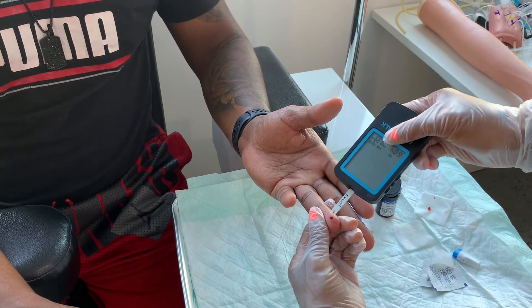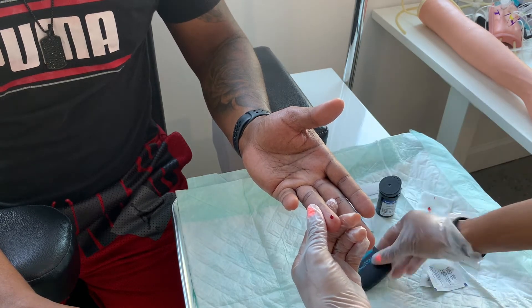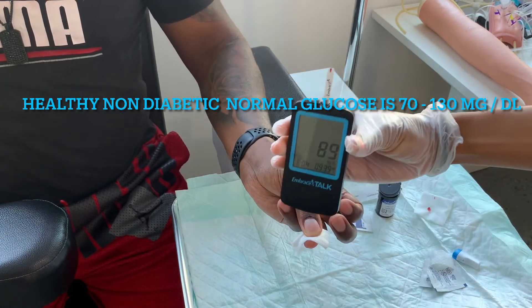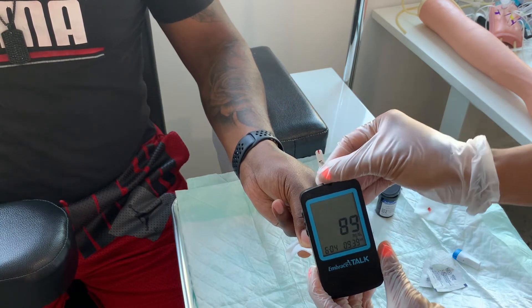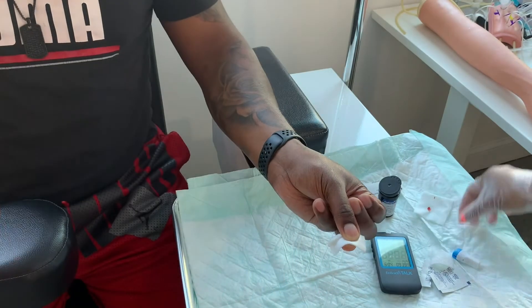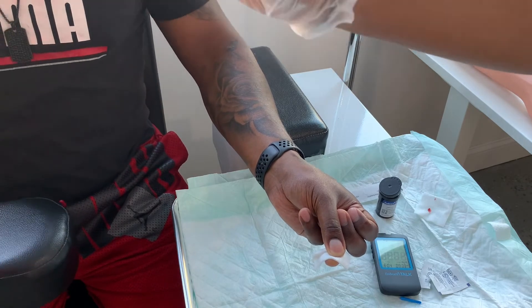Take the strip and go ahead and apply it to the little blood that's there. It only needs a little blood just to read the person's glucose. Ask the patient to hold pressure. As you can see, it's 89 milligrams per deciliter. The normal levels are 70 to 130. It's extremely important if you're working in any facility to know what the levels are.